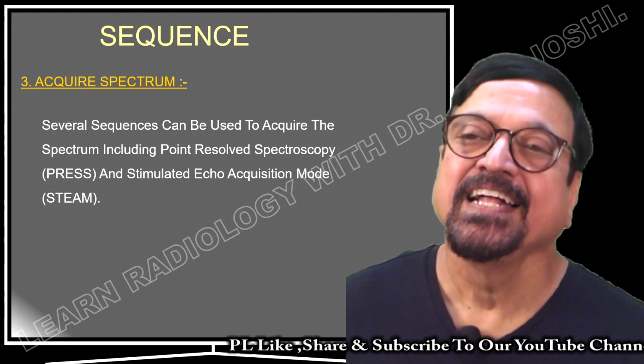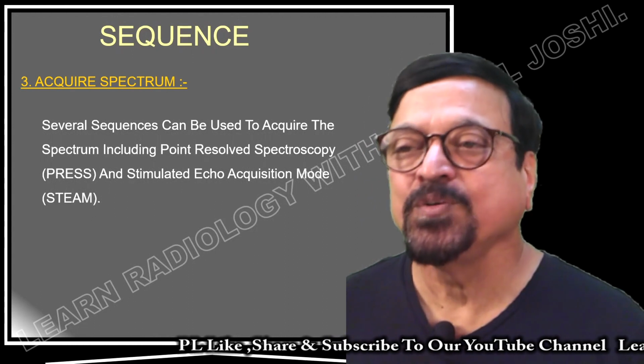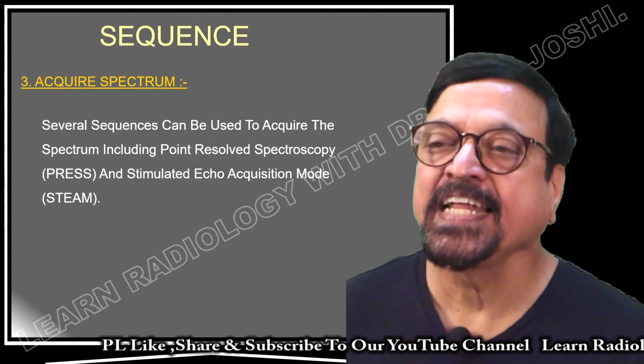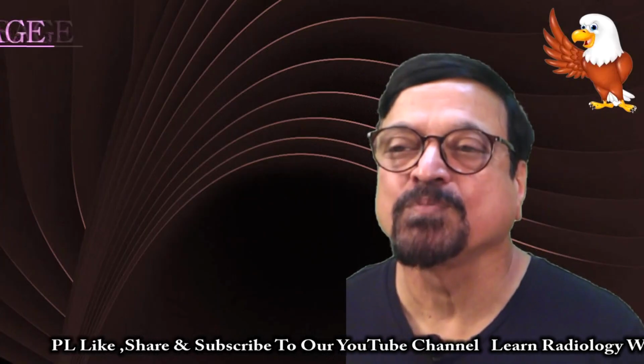Then there is the acquired spectrum. Sequences can be used to acquire the spectrum, including point resolved spectroscopy, that is PRESS, and stimulated echo acquisition mode, that is STEAM. These are the short forms of the modes.